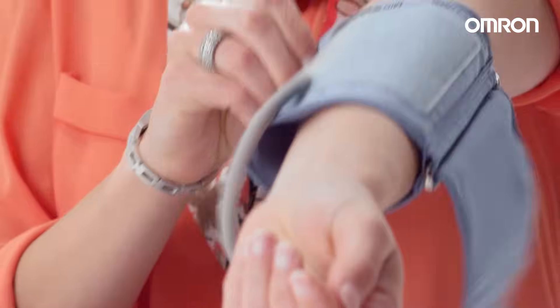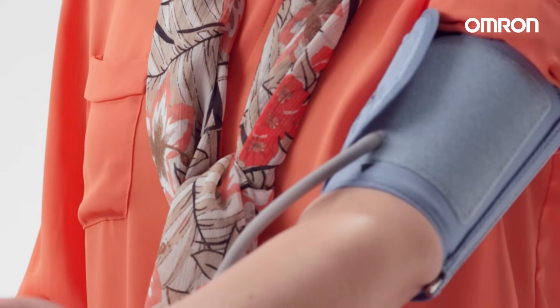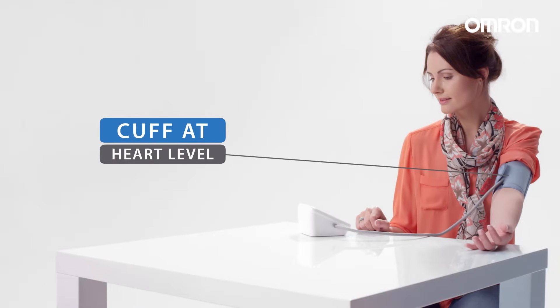Wrap the cuff around your upper arm, making sure it's 1-2cm above your elbow, with the marker lined in the middle of your inner arm. It's important that the cuff fits neatly onto your arm. During the measurement, the cuff should be at heart level.